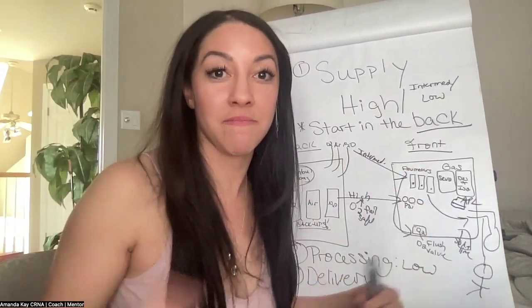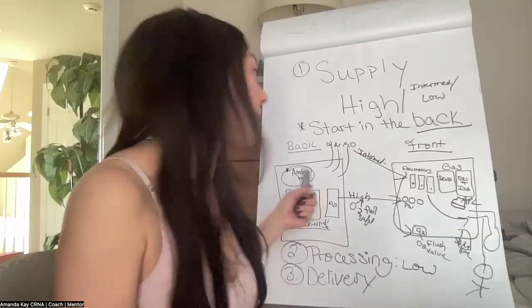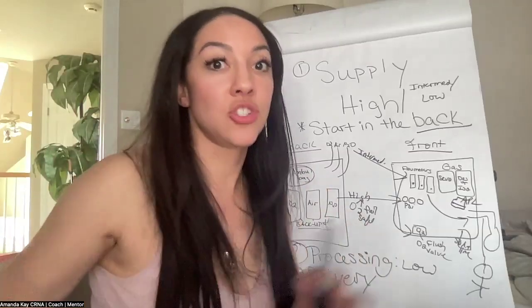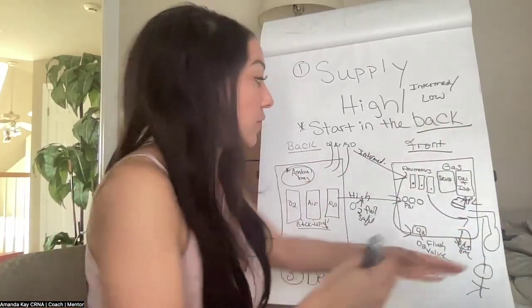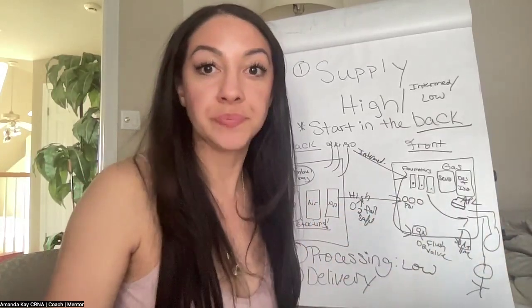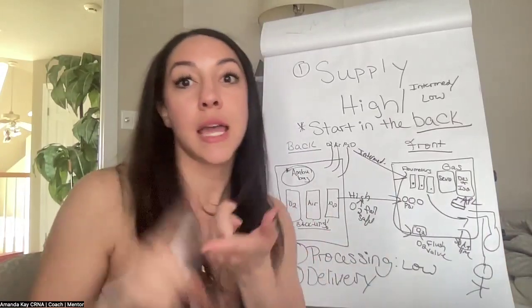So just all those things to think about. Take a deep breath, stay calm, and try to find the source of whatever the leak is. And remember, that's why you always want to have an ambu bag, because you always want to have another source of oxygen just in case something happens with your machine. And then you just keep calm and you work back, checking things.